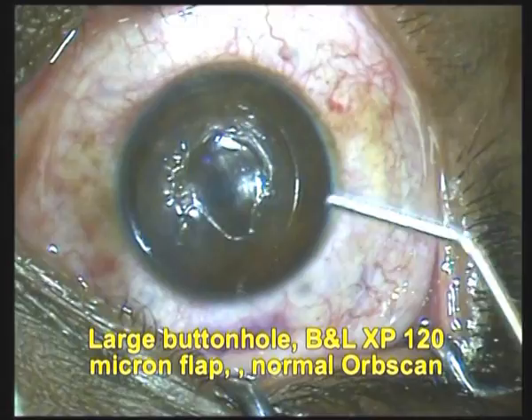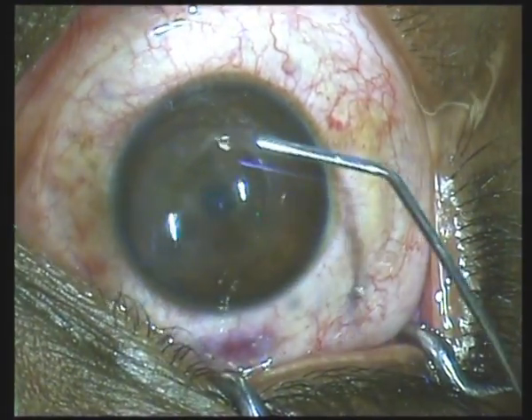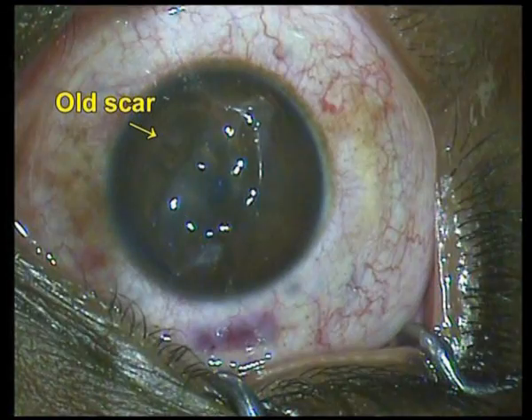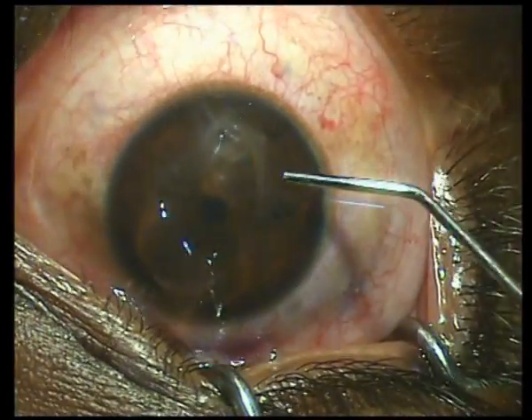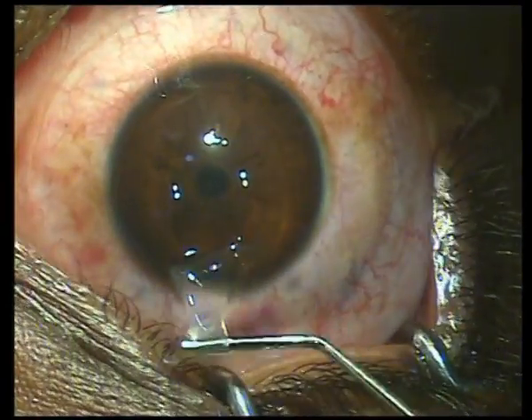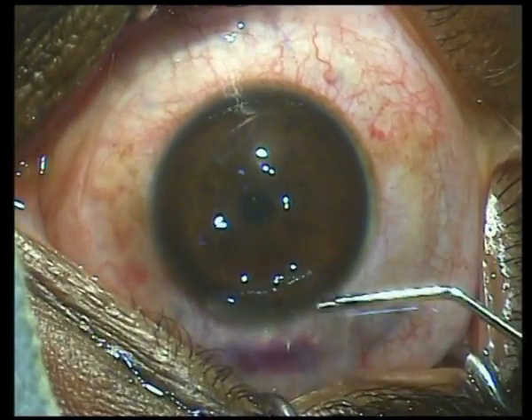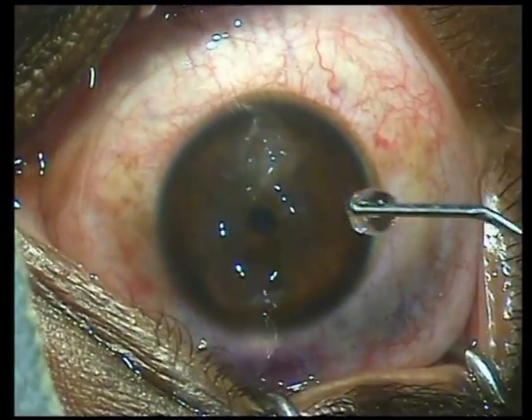Some days are longer than others, and anybody who saw this in the first eye of a routine LASIK would definitely realize that this day would surely prove to be one of those. Being called urgently in the refractive suite is generally not something to look forward to. Here was a humongous buttonhole in surgery by the resident in a patient who had come from out of the state. After a thorough examination, it was not difficult to come to the conclusion that there was really not much to do other than replace the buttonhole flap back.